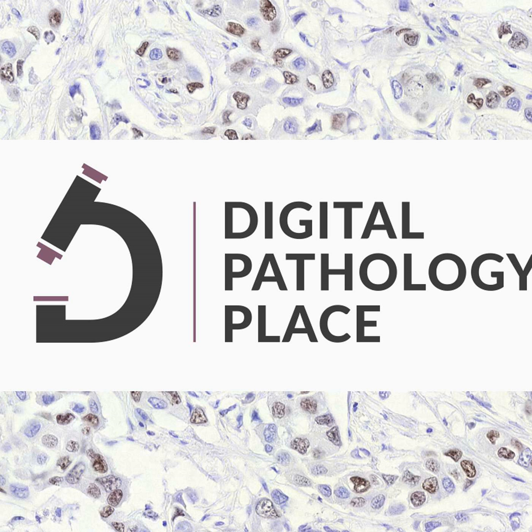So concordance between AI and pathologists was 93.2 for detection of high probability cancer, 99 for low probability slides, and then there's some intermediate probability, and their cancer was confirmed in 4.7 cases. Gleason grading concordance rate was 76.6, and the integration of AI has not changed the use of immunohistochemistry. So that's interesting. They still use the same amount of immunohistochemistry.